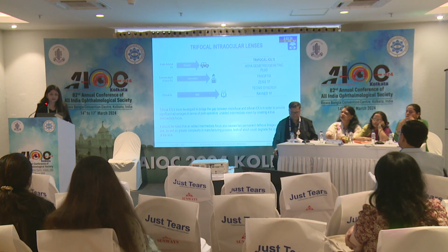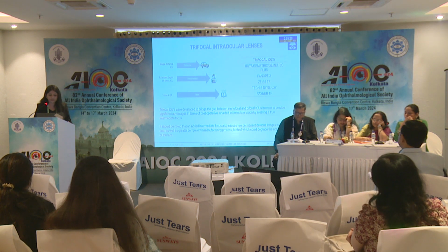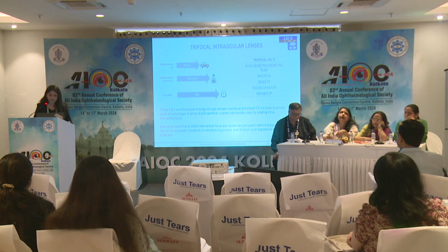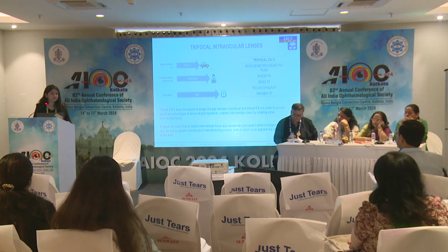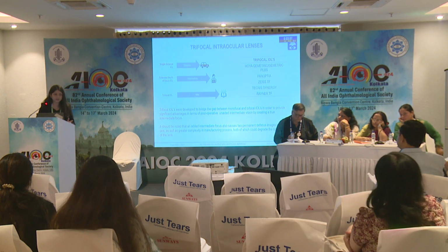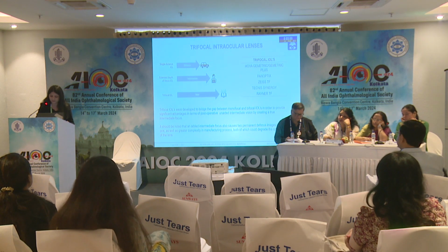Then we have the extended EDOF lenses that help in distance as well as intermediate vision, but do not help near vision, which is the downside. And then we have the bifocal lenses which help in distance and near vision, but do not help in intermediate vision. So to bridge this gap between monofocal and bifocal lenses, the trifocal lenses were introduced, which generate a true intermediate focus, helping intermediate distance and near vision.